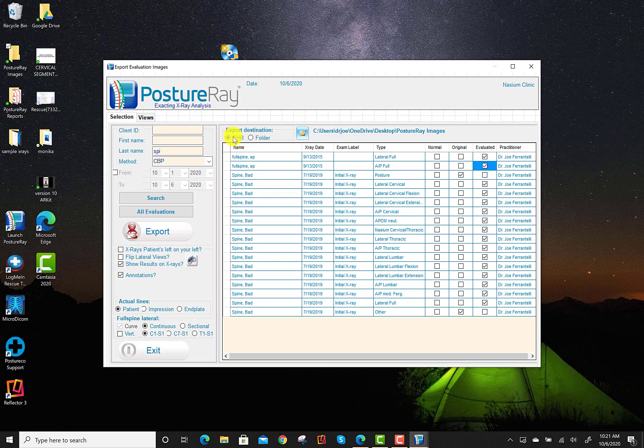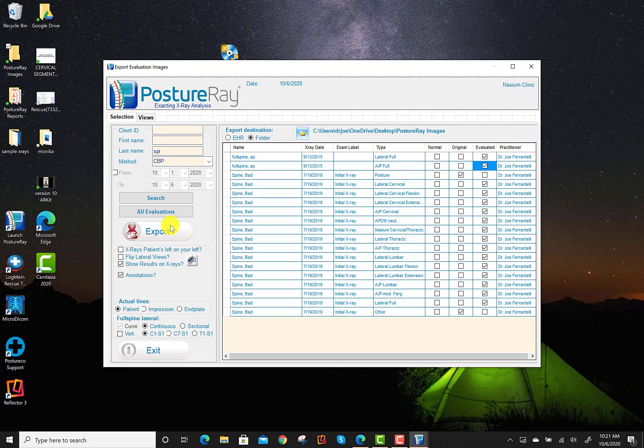So now, to export to a folder, click folder. What's the location? That's the location that I want to do. Do I want to export any annotations? Yeah, we'll go ahead and do that. That's the arrows and circles and things like that. And now, when I hit export, it's going to export to that folder in this location. If you need to change the location, just click here. So I'm going to go ahead and hit export.